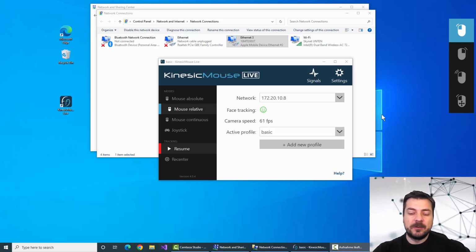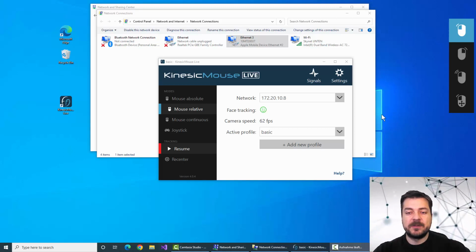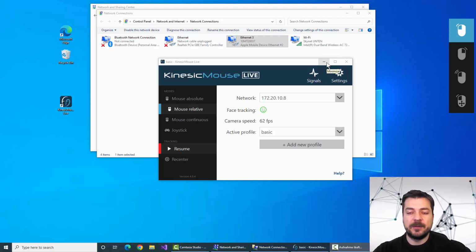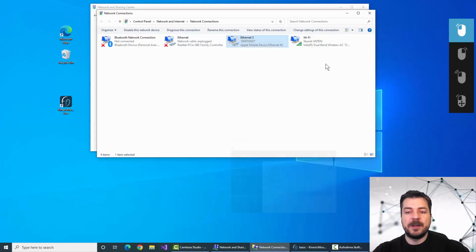Now you may want to use the internet connection from your facility to browse data and download websites, and not your Apple shared iPhone connection. To prefer your stable connection, we can actually do that by going back to the network settings.